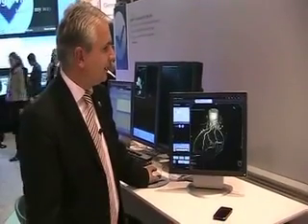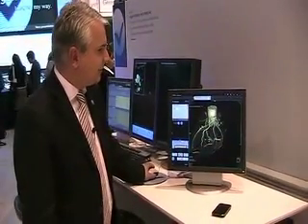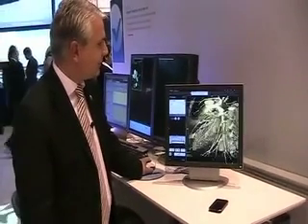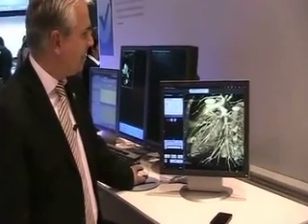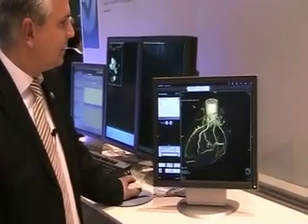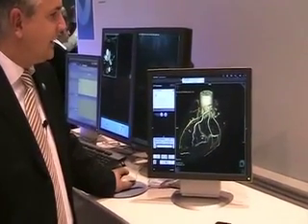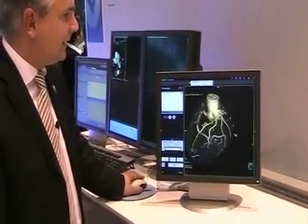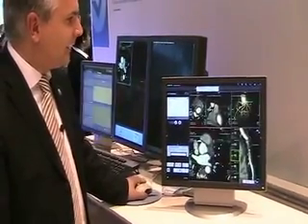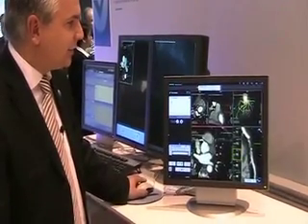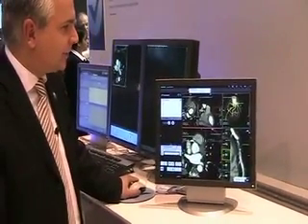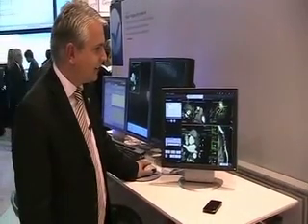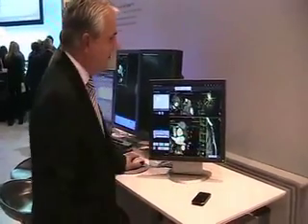A good example here is the VRT. You have the blood pool and the bones removed — you would get the images normally like this from the CT scanner. The system automatically segments it, removes it, and labels the coronary arteries, and you can rotate it around and look at it from any angle. You can automatically measure the occlusions in the artery. You have the curved MPR in here and you can see here how the area is being measured.